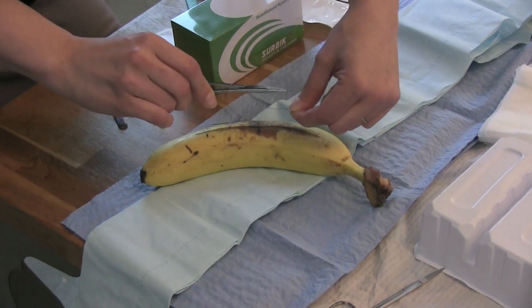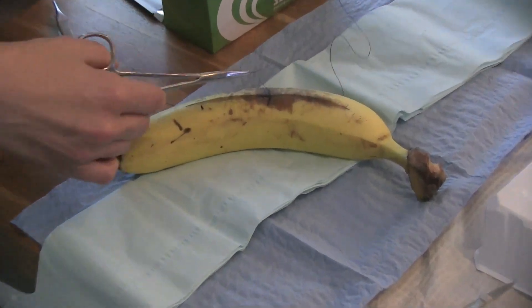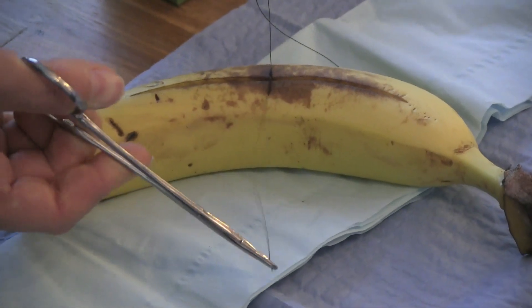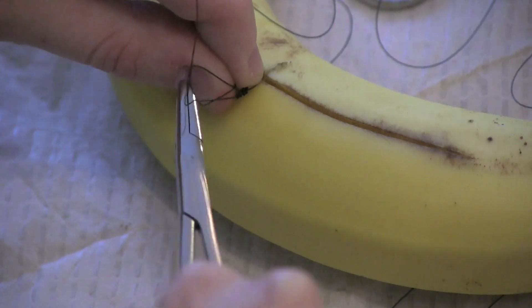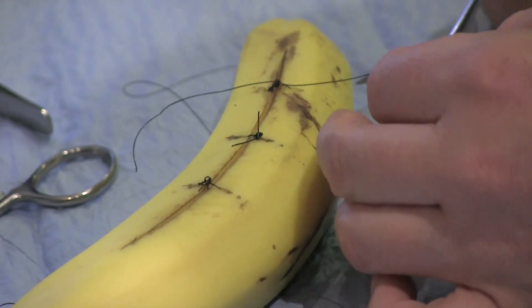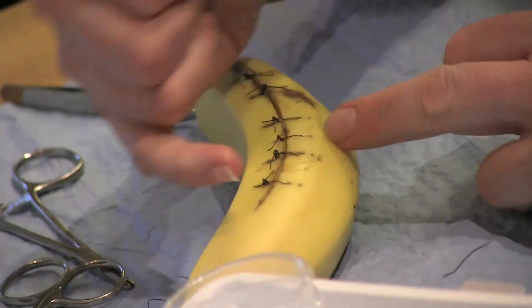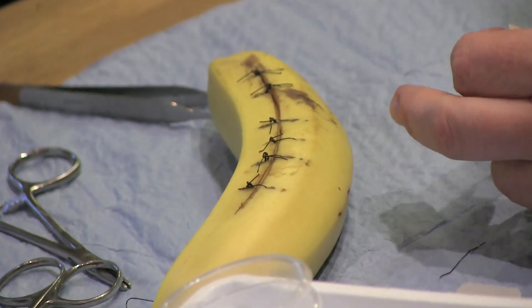Then for your second knot, wrap your thread around only once, going the opposite direction, pull through, and now you're back to your original position. For your third and fourth knots, you only have to wrap your thread around the needle driver or tweezers once. Then clip the thread down to about a half inch left. Ideally, you'll want your knots not directly on the laceration, but off to one side.